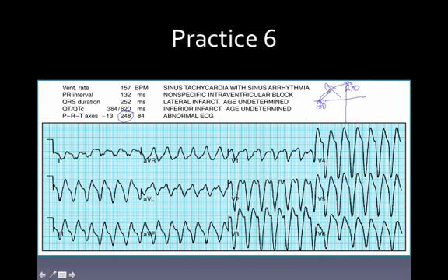This is ERAD quadrant, according to that, and below the isoelectric line. So down, down, down. All 3 leads' perspective, 0 degrees, 60 degrees, 120 degrees, say that it's headed away from them. Probably ventricular in origin.